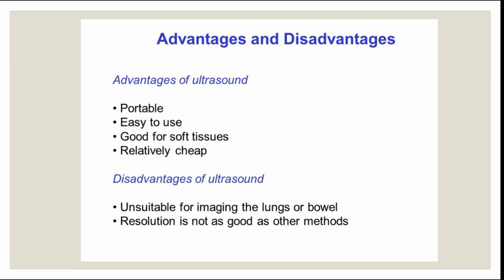Do you guys have any clue when that could happen? In newborns, yeah. And do you know why? Yeah, through the fontanelle, exactly. Yeah, could also be. And for example, if someone removed a part of their skull, for example, to treat intracranial hypertension, you can also use ultrasound. But usually it's for newborns and the fontanelles because the bones are not ossified yet.